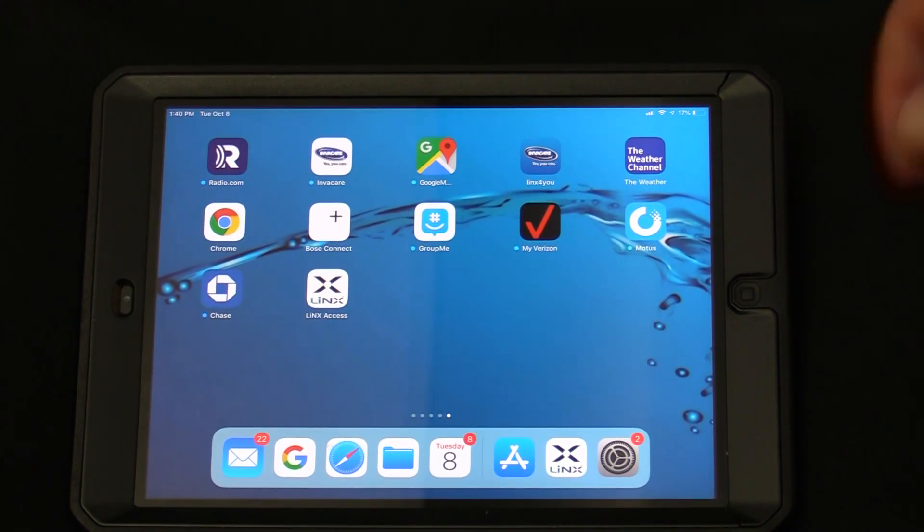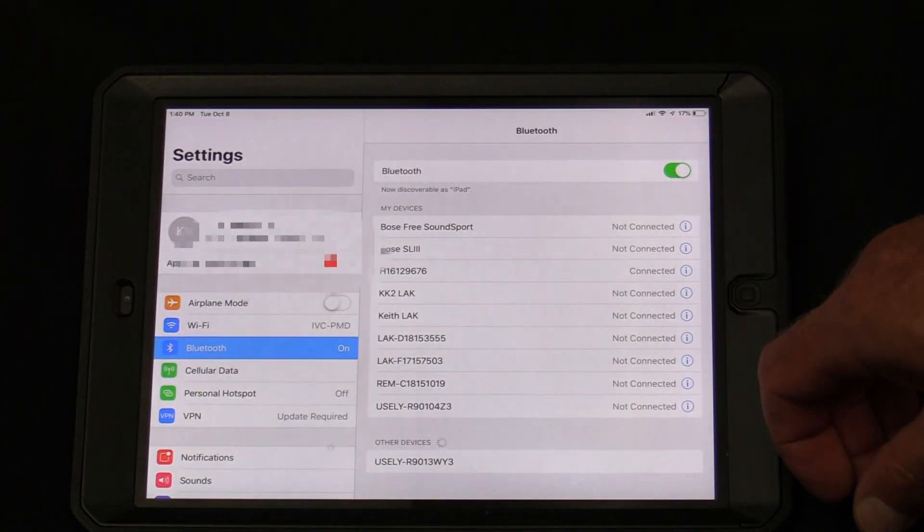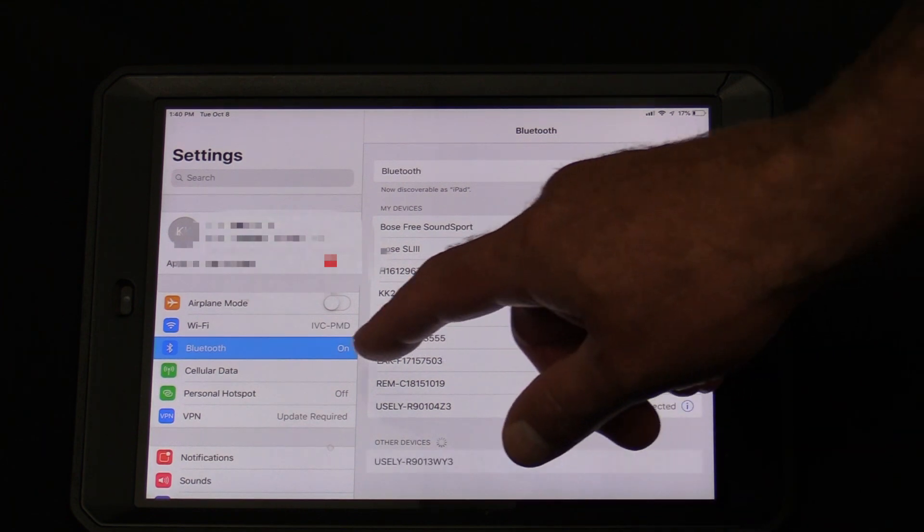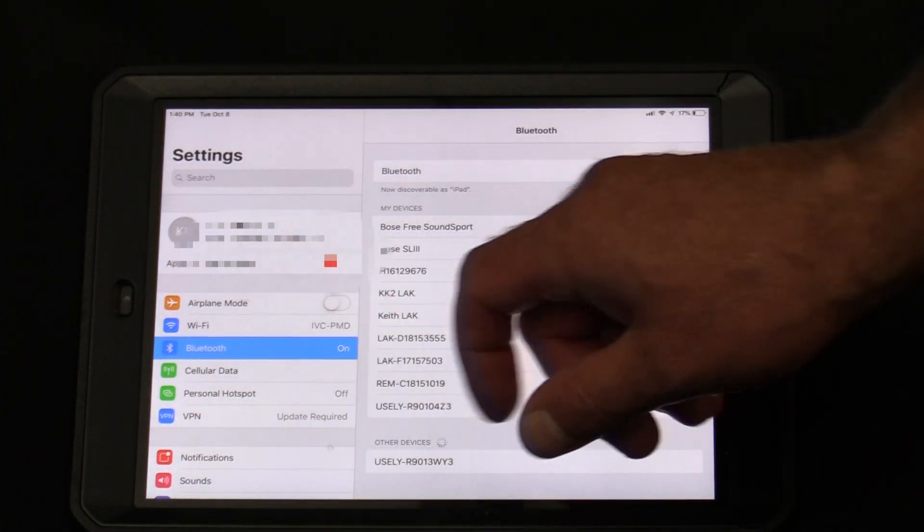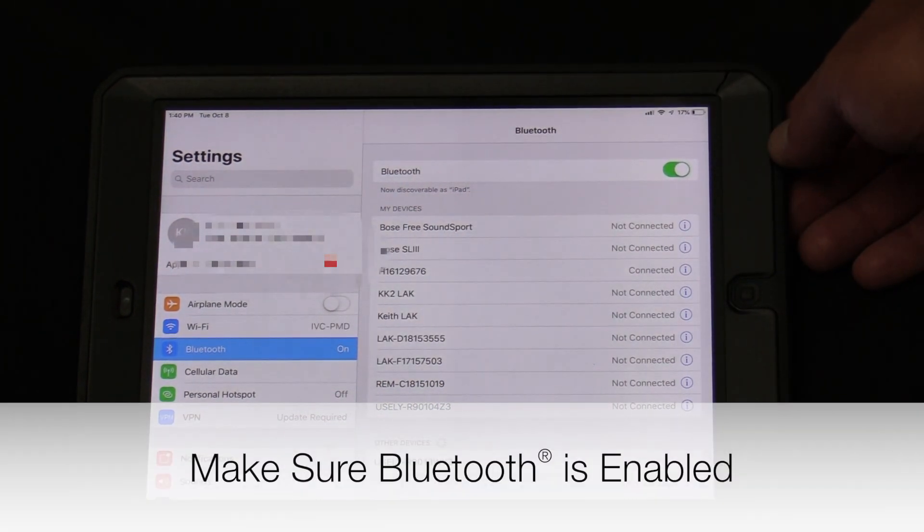Go to your device's settings and make sure that your Bluetooth is turned on. Click Bluetooth and make sure that Bluetooth is on with the green button.